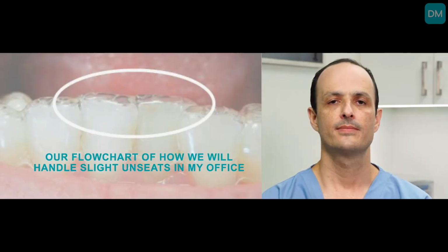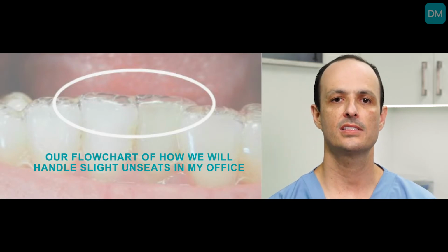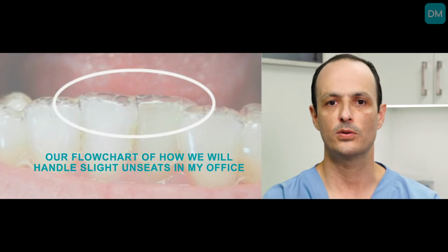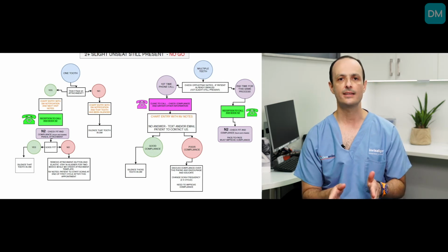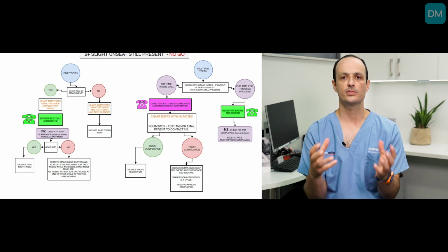In dental monitoring, there's a term called slight unseat. In this picture here, if you look closely, you can see the edge of the aligner sitting a little bit off the edge of the teeth. That's simply called a slight unseat or a slight gap. We created in my office a flowchart, as you see here, about how to deal with slight unseats. This will be incorporated into the dental monitoring software.